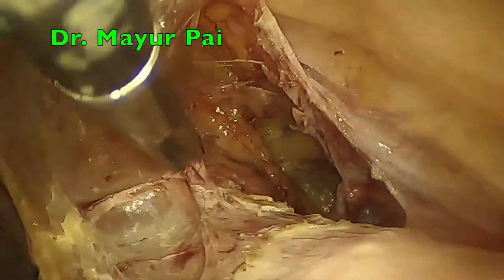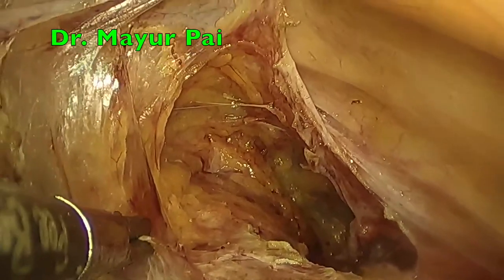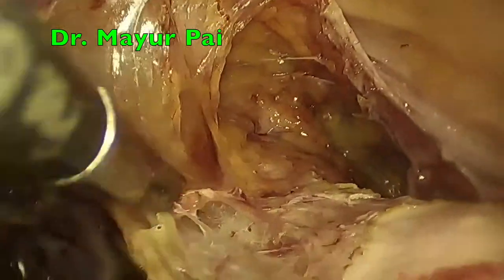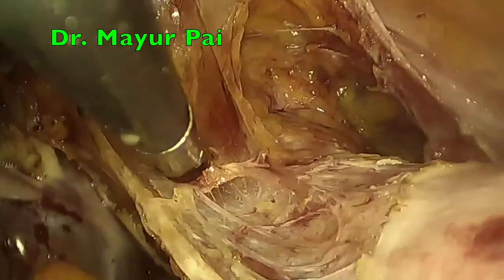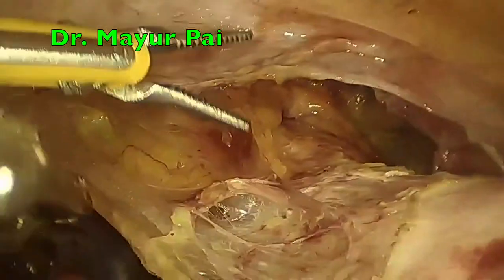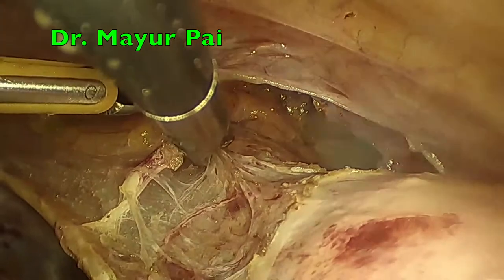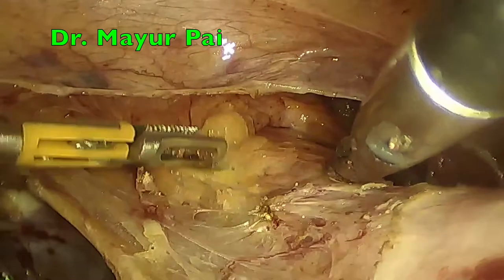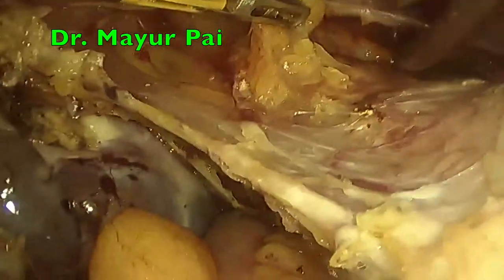So now we are getting rid of some of the connective tissue on the left hand side and exposing the uterine vessels. We always devote some time to the skeletonization process and the bladder pillar dissection, which exposes the uterine vessels completely. When almost 3 to 4 cm length of uterine vessels is available for coagulation, that's when we begin the coagulation process.